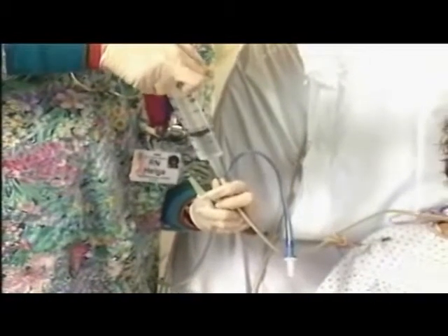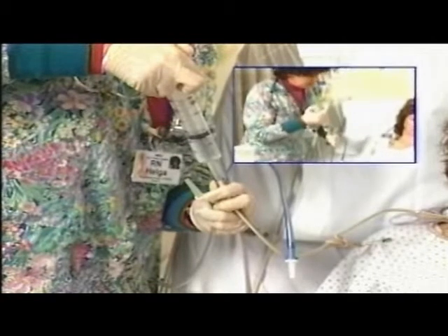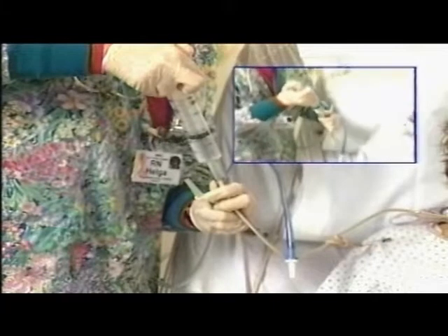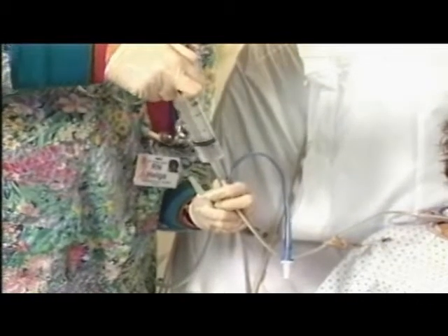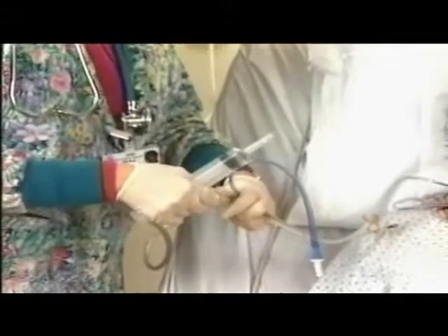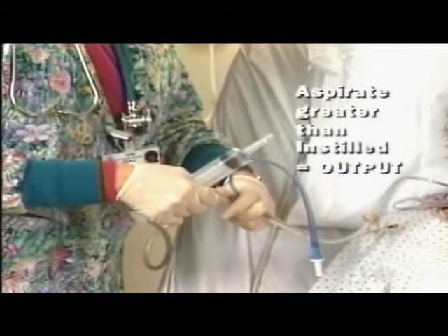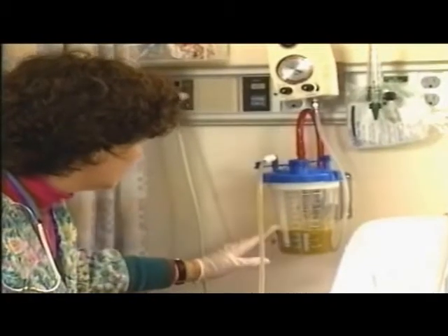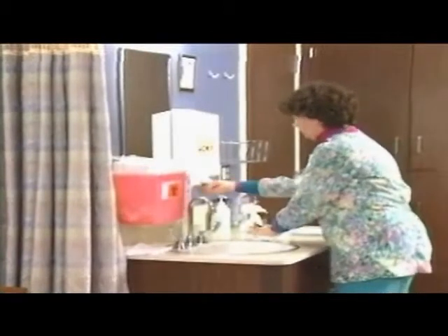Insert the tip of the syringe with tip down and slowly instill the solution — be sure not to force the fluid. If gentle pressure fails to clear the resistance, turning the patient may be indicated. When suction is not available, a syringe is used to aspirate irrigant. The amount of aspirate may be more than the amount instilled — if so, the excess is considered output. If the aspirate is less than the amount instilled, it is considered intake. Note the color and amount of drainage. This information is documented in the patient record. Finish by removing gloves, washing hands, and documenting the procedure.